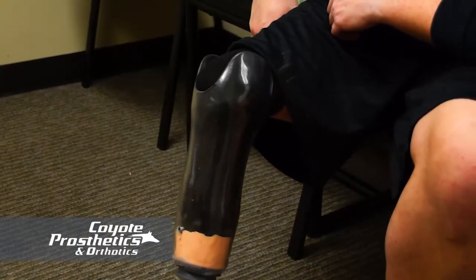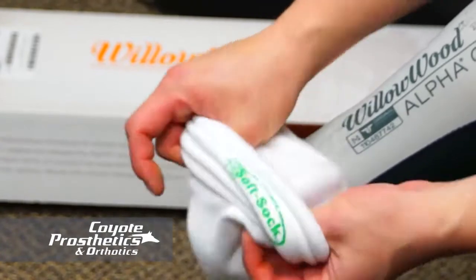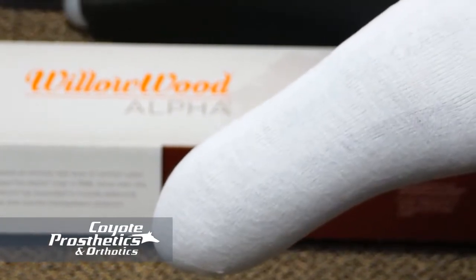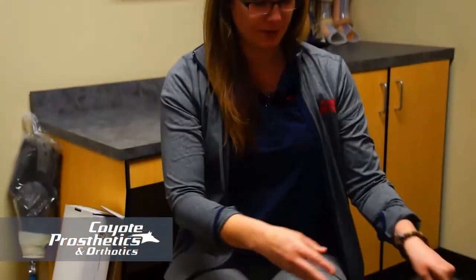And then one big question is, how do I know when to add a prosthetic sock? And there are probably a lot of different right answers. The most common is that you're going to feel pressure on the bottom of your limb. And the reason for that is that we're not holding you up at the top here anymore. Because you got smaller, you drop into the socket, and you feel that pressure on the bottom. In the beginning, you should feel maybe a tiny bit of pressure on the bottom. We want you to have contact with the bottom, but we don't want you to have that kind of pressure on the bottom. That's the general rule, though it's not always the case. So if you have any issues or problems, as always, definitely talk to your care provider.